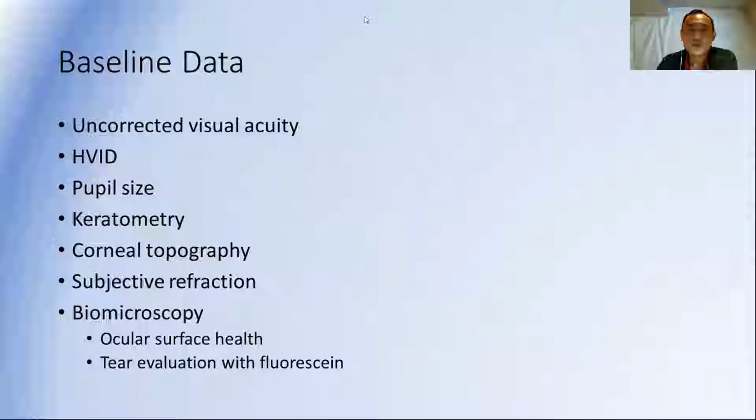Ideal age to start treatment as myopia control, I say the earliest possible, as long as the child can tolerate it and understands what the procedure is going to do on a nightly basis, and as long as the parents agree to it. If you can start treatment when they're -1 or -2 versus waiting until they're -3 or 4 or 5, it's definitely better.